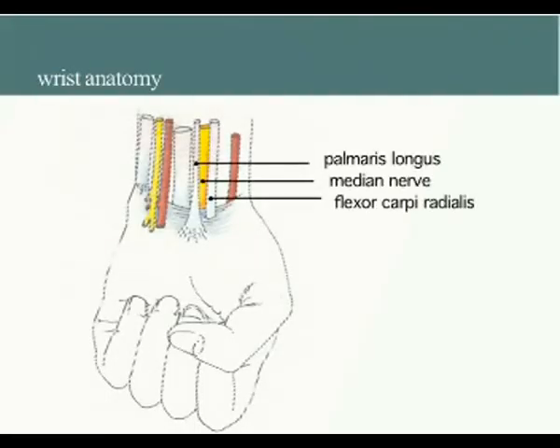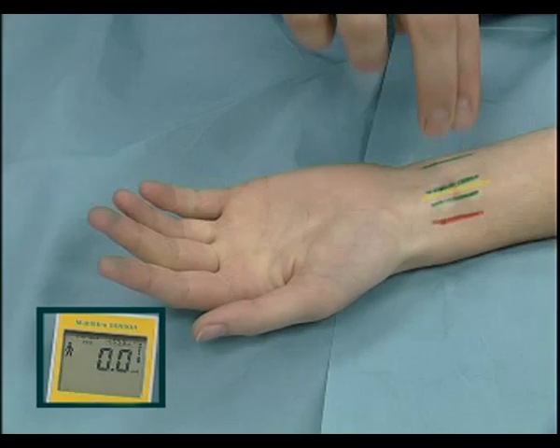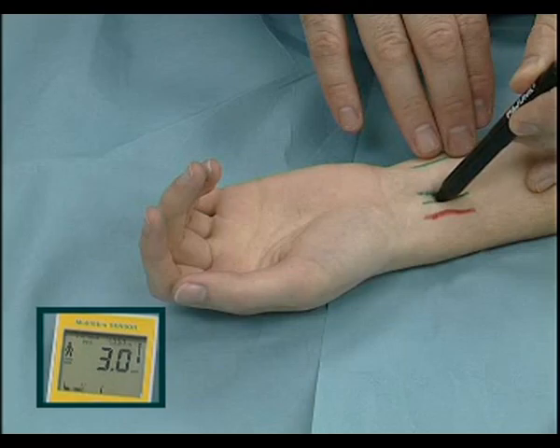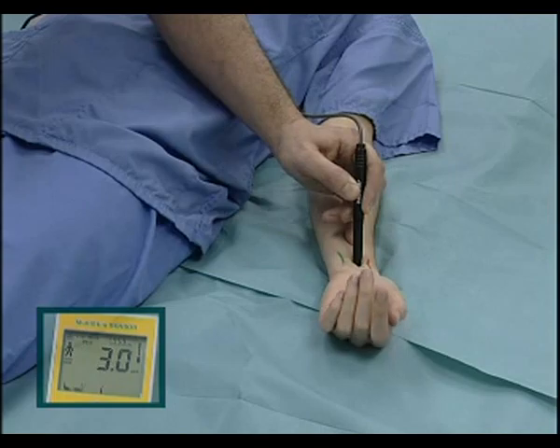Upper limb blocks. We will display the location of the peripheral nerve by assessing the sensory or motor endpoint. Wrist block, median nerve. At the wrist, the median nerve lies between the palmaris longus and flexor carpi radialis tendons and deep to the flexor retinaculum. Paresthesia is into thumb or index finger. Motor response elicits twitching, mainly into the thenar eminence with some thumb abduction.